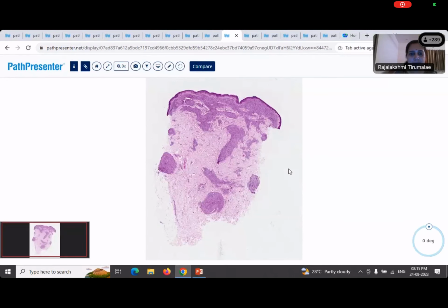Yeah, go ahead. H&E stained sections are showing normal looking epidermis, but we can see a hypocellular zone which is separating the epidermis from the papillary dermis, which is called the Grenz zone. And we can see a dense inflammatory infiltrate. I'm deliberately not going to the higher magnification because there is something I want you to pick up on. This pattern is virtually diagnostic of this disease.